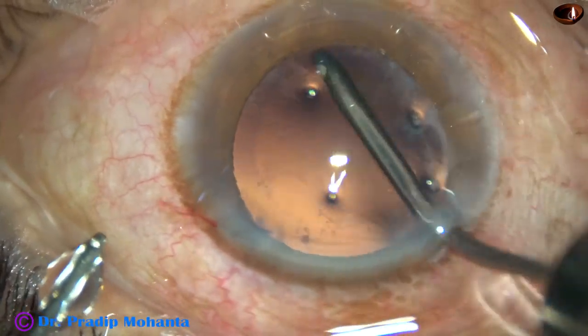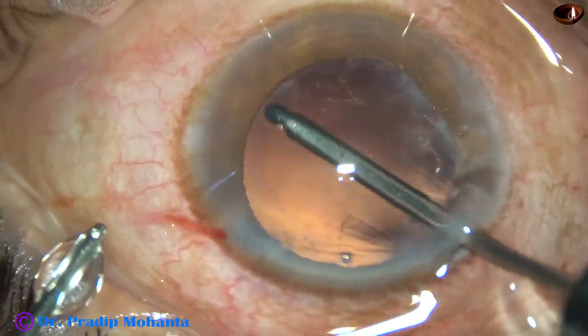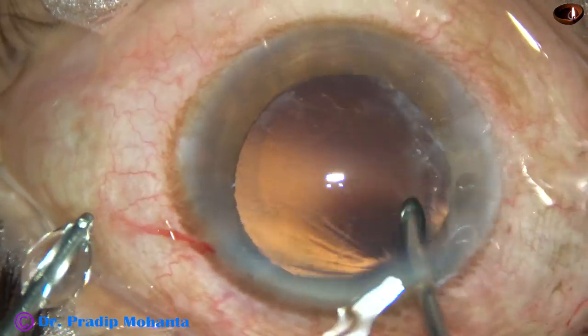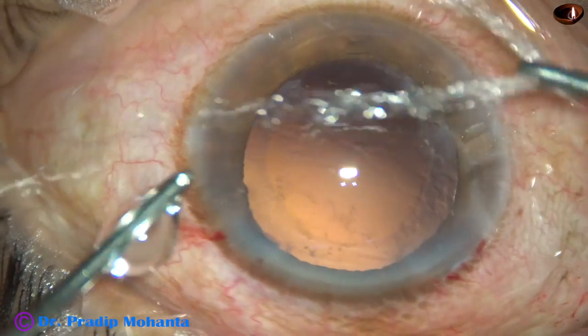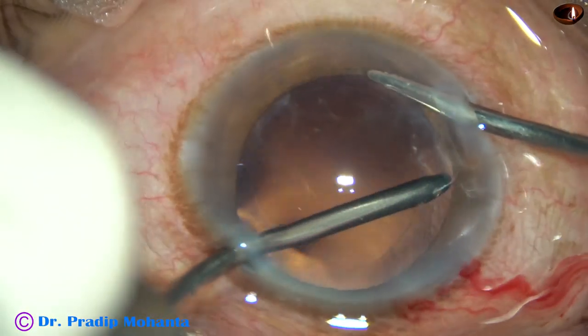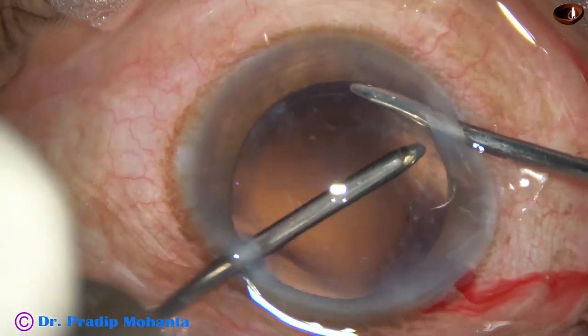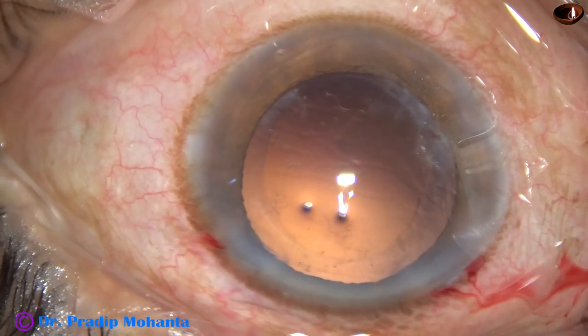Now this is what I call hydro-polish. The capsule is polished by an irrigating jet of fluid. Some lens fibers are still present under the anterior capsular rim and are removed.